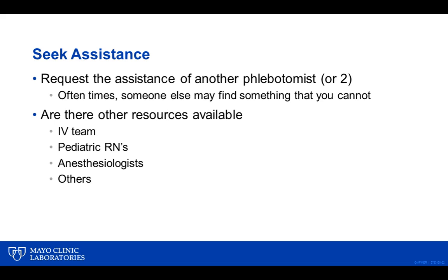We can't draw from lines except for Z lines. But we're working with RNs. There's different areas, but if I have a difficult stick and I'm not finding anything, or I've already stuck twice, and that's our limit here, you can only stick twice and then somebody else has to take a look. But if I'm not finding anything, I go to a phlebotomist to help me. They know what they're doing. They've got their techniques, and there's good days and there's bad days.